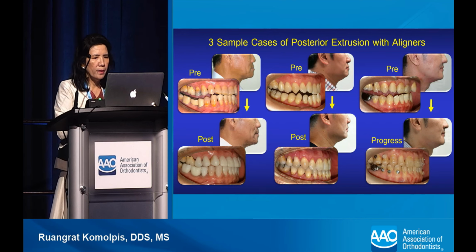I think they all have better profile. The first and the third one have the clockwise rotation. The middle one, because of the small open bite at first, we didn't have much rotation. We even have the lower face height reduced.